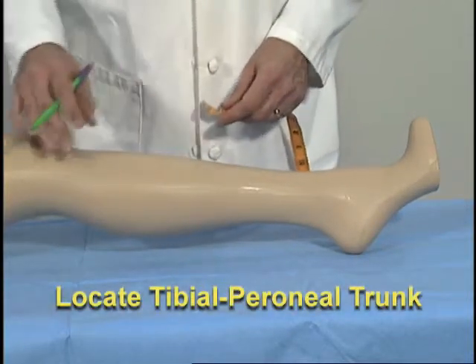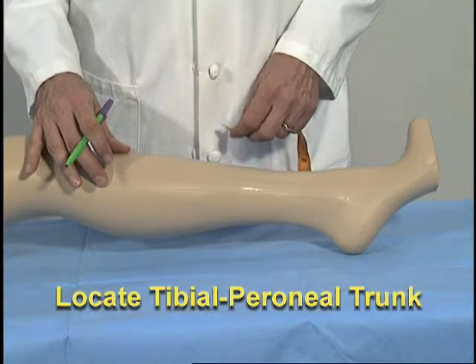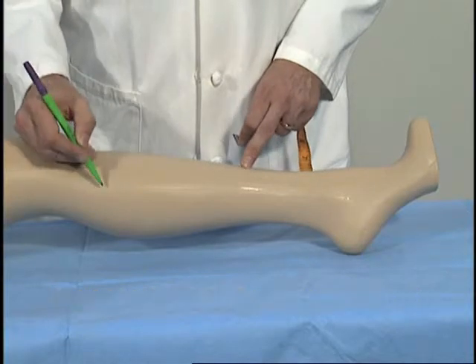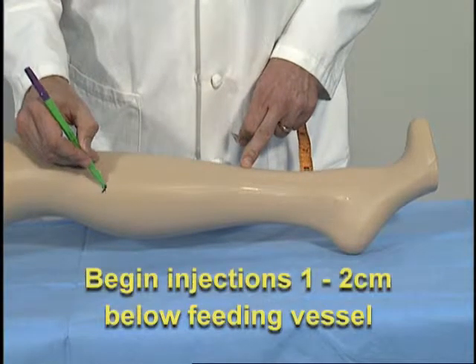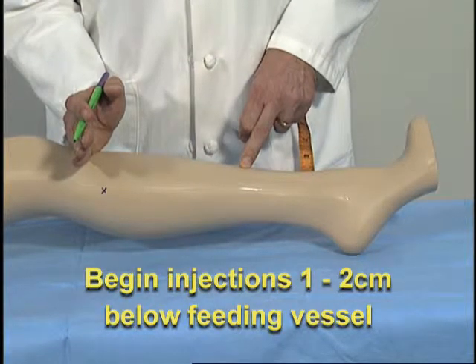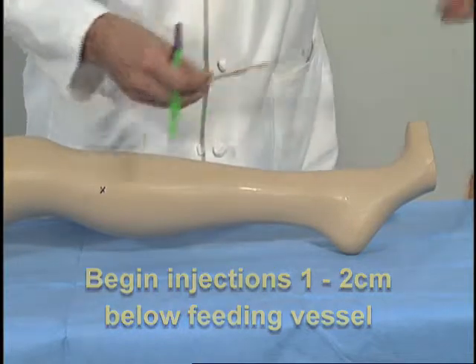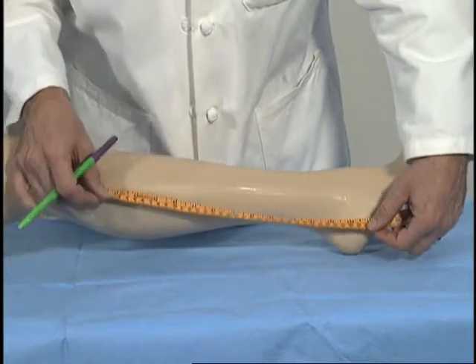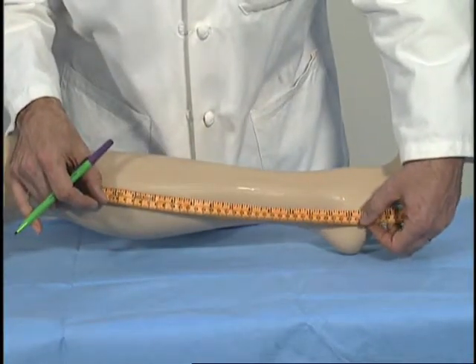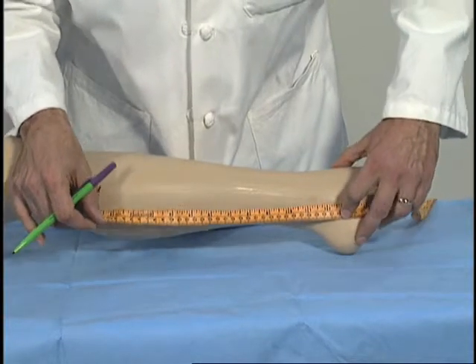Using ultrasound guidance, we'll find the tibial-peroneal trunk. It should be relatively easy to identify. And again, 1 to 2 centimeters from the termination of your feeding vessel should be the beginning of your injections in every case. Here, our distance from the tibial-peroneal trunk to the ankle is about 32 centimeters.